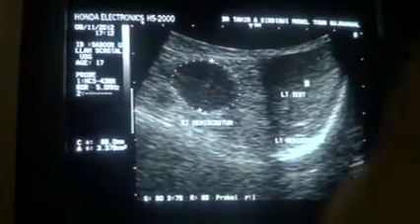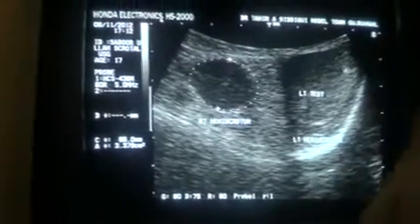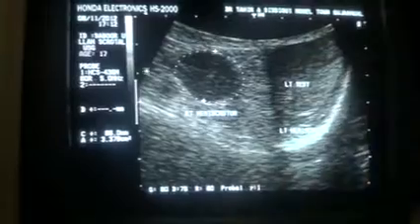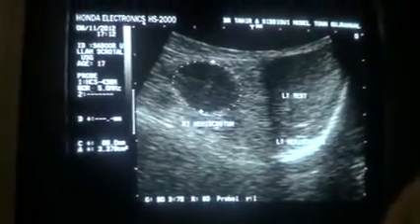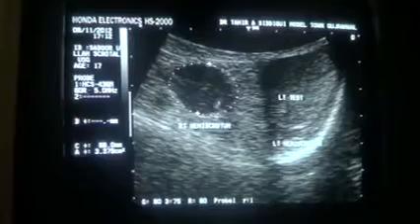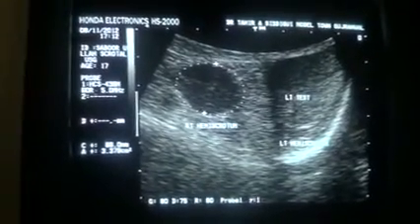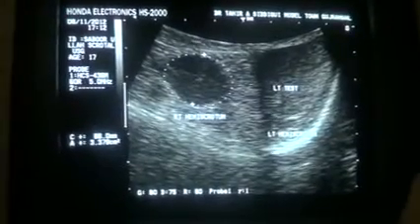Now this thin line is the mediastinum testis. So now in the right hemiscrotum we do not see any testicular tissue, or rather only a hypoechoic well demarcated mass is seen, with no calcification in it.